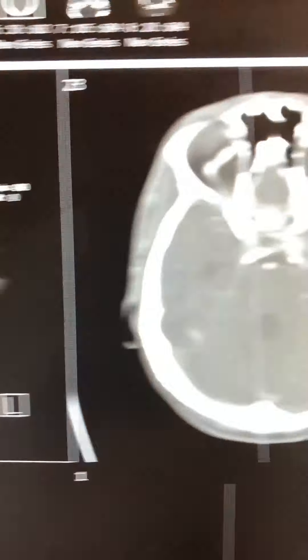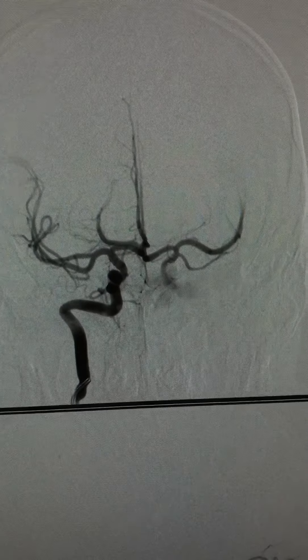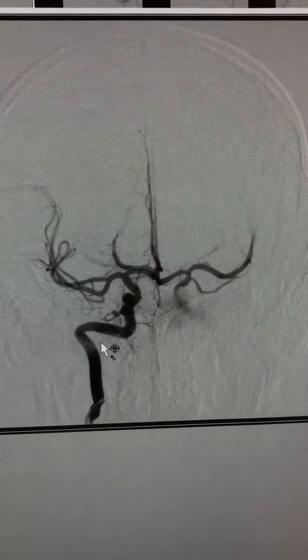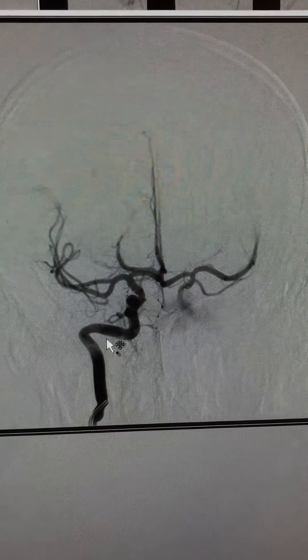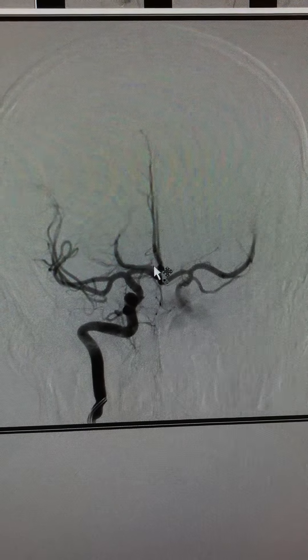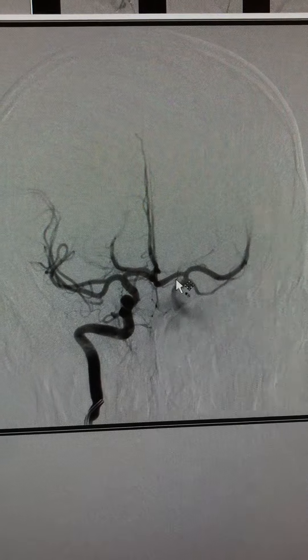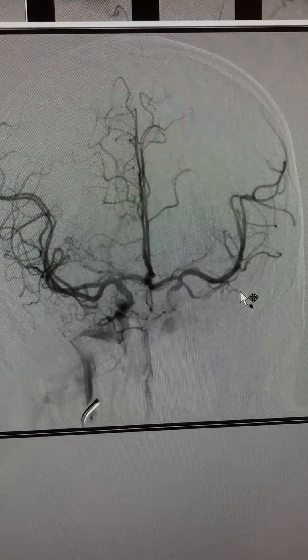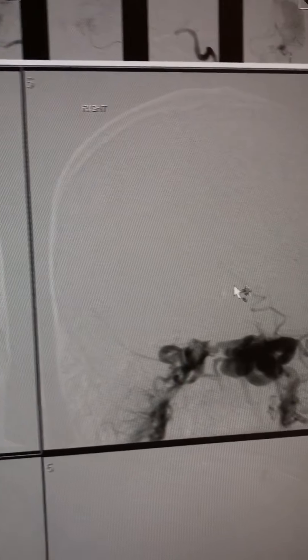We brought the patient for endovascular treatment. This is the right side injection — as you can see, there is flow to the right hemisphere, and most of the flow to the left hemisphere is actually arising from the right side. When we inject the diseased side, you see there is no flow. Injecting now from the left side, you see almost no flow at all reaching the brain.